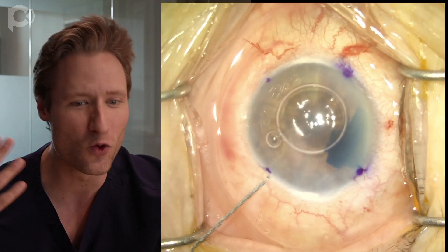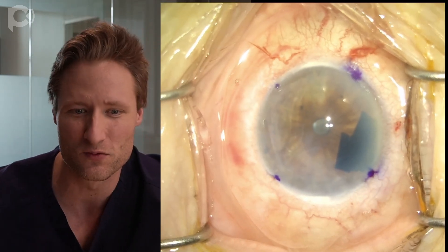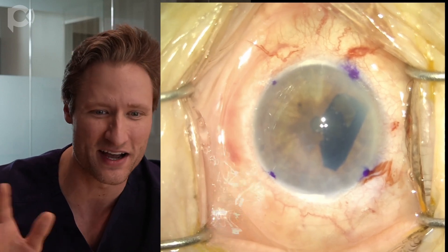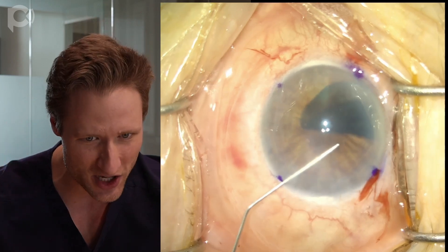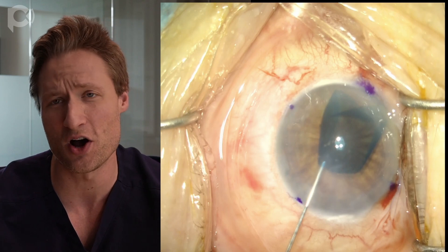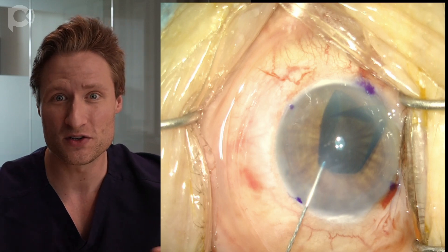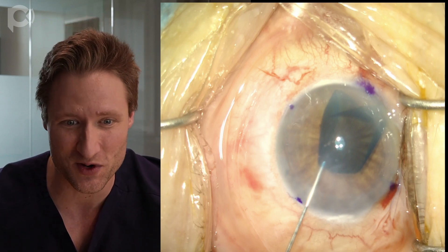Once the graft is in, the very first thing you do is remove any air bubbles, because they push the graft out of the way and prevent you from unfolding it. Then you deepen the chamber with more saline. Now, the graft is a little wadded up and the chamber is a little shallow, so you just deepen it with saline. The next important step is to verify whether the graft is right side up or upside down before you start unfolding it — here, we're not using an orientation mark, but you need to check orientation first.